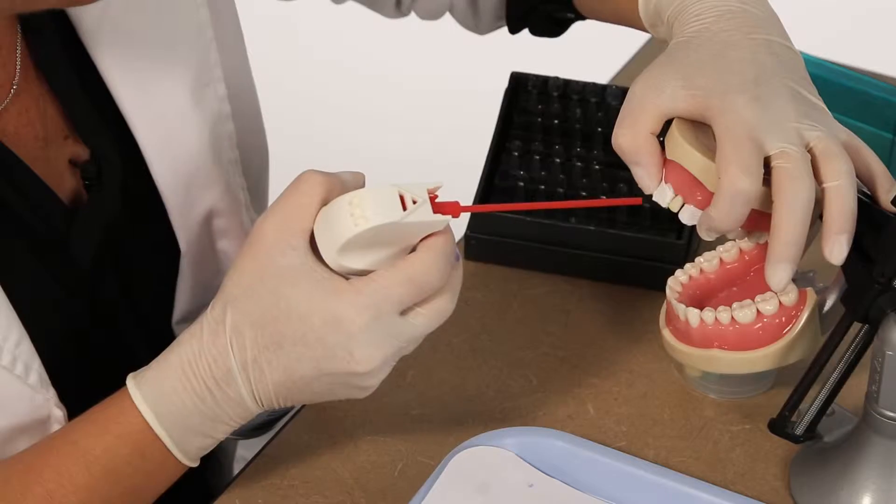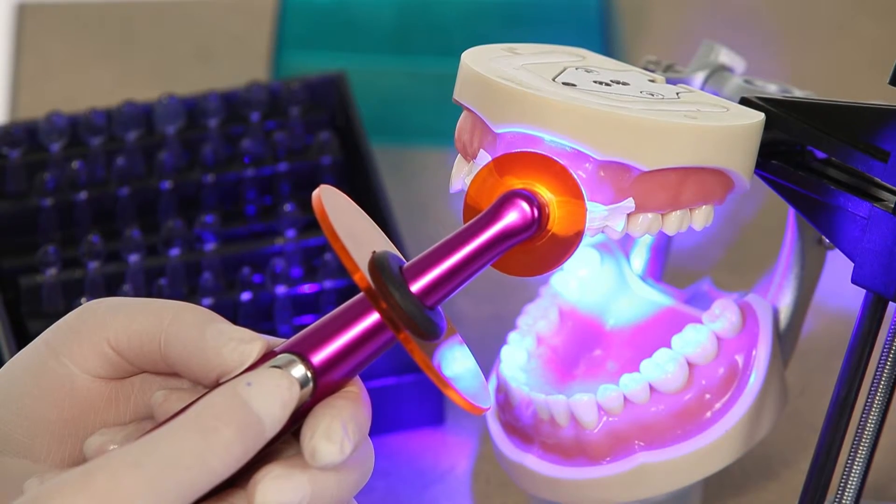Apply bonding adhesive to the tooth, air thin, and light cure for 10 seconds.